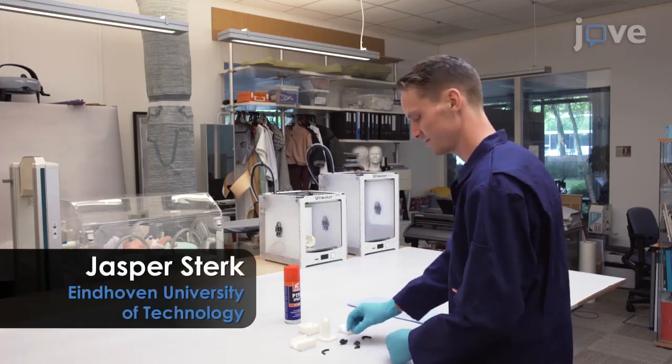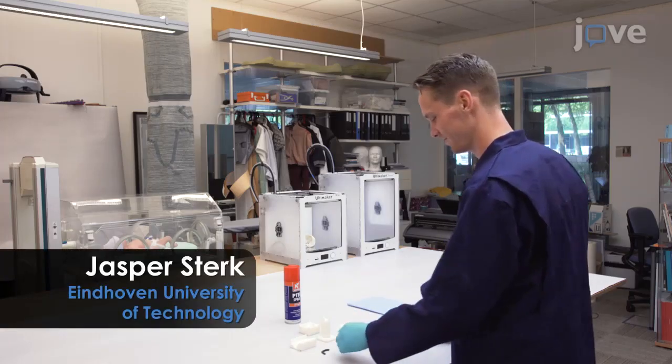This method can answer key questions in the neonatology field, such as how much cardiac output is generated during chest compressions. The main advantage of this technique is that it enables the creation of a flexible heart model without the loss of anatomical realism. Demonstrating the procedure with me today will be Jasper Sterk, a technician from our laboratory.